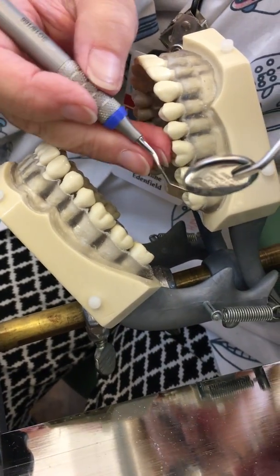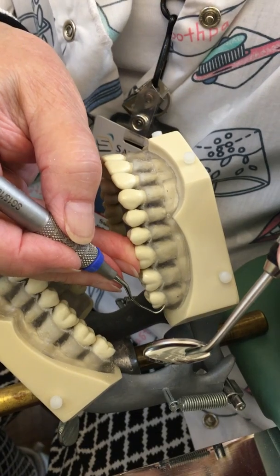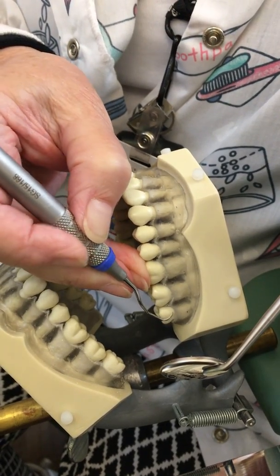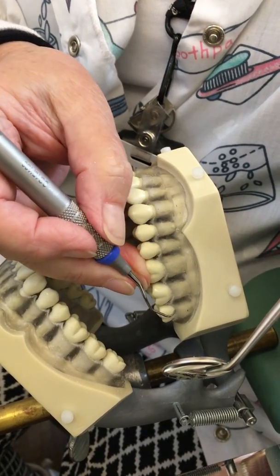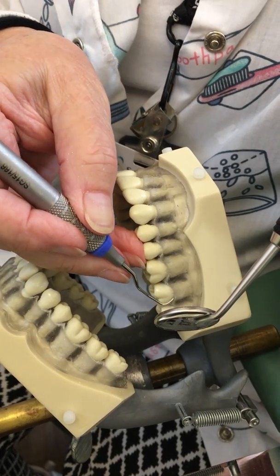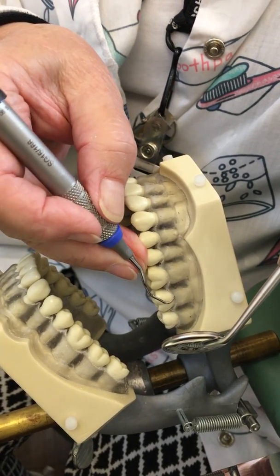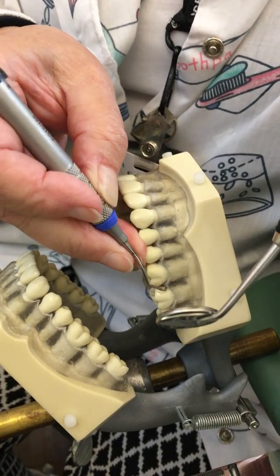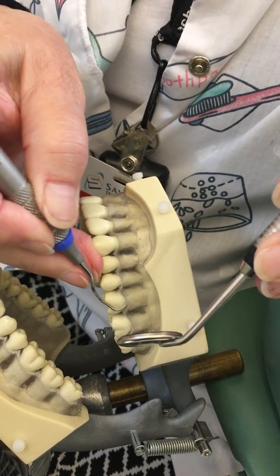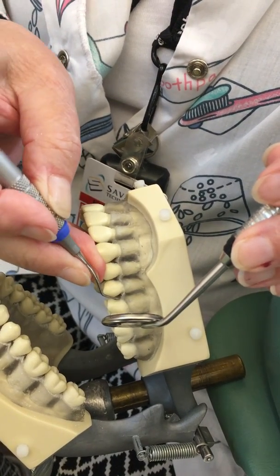Now we're going to move to area four, which is the mirror image of three — doing the mesials with the 15/16 Gracey. I'm going to go in closed and open. In three I used complete indirect vision; in four I'm using both direct and indirect vision. I'm using my mirror to retract the cheek, give me some illumination if I need it, and also to see around some of the corners of the teeth. But I can see some of it with my eyes directly.